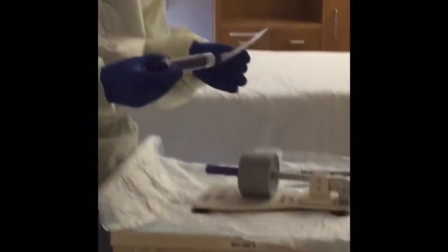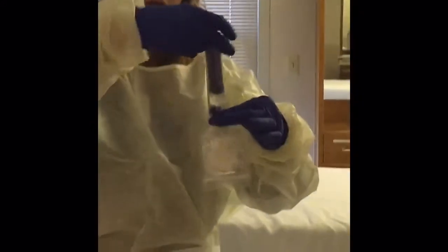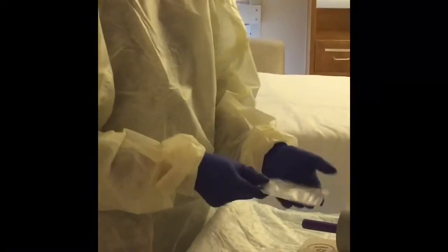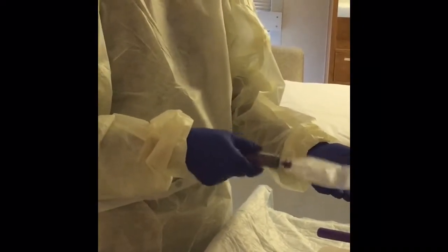That looks pretty good right there. You can see it's pretty well pulverized. And so at this point, I'm going to inject my water. And I'm just going to start mixing it. We want to make sure that gets pretty mixed up so that that pill is dissolved.